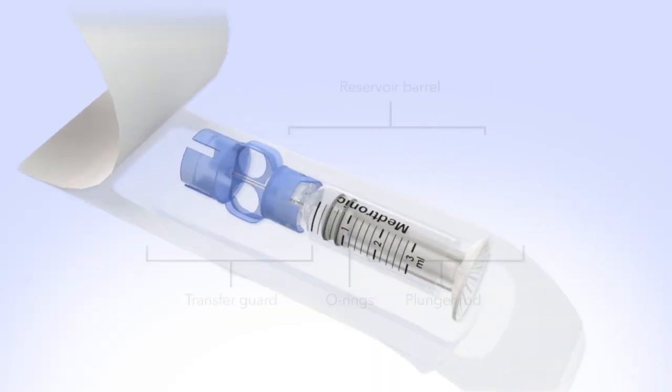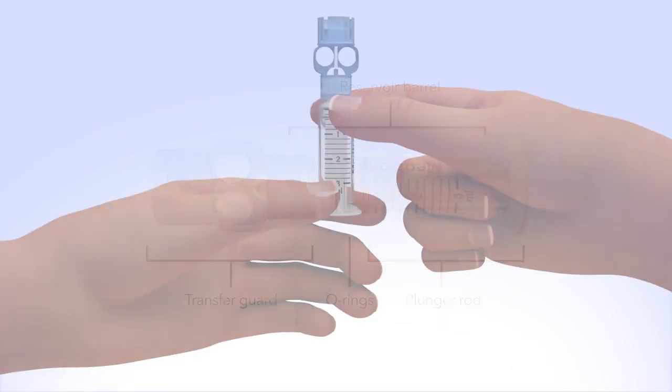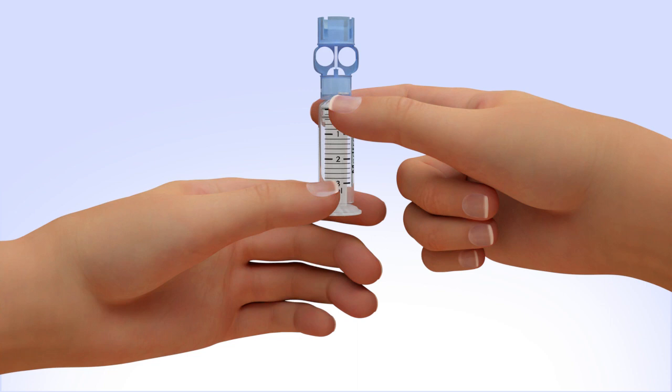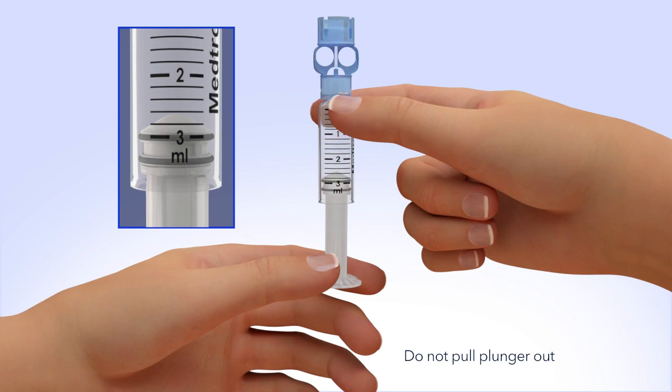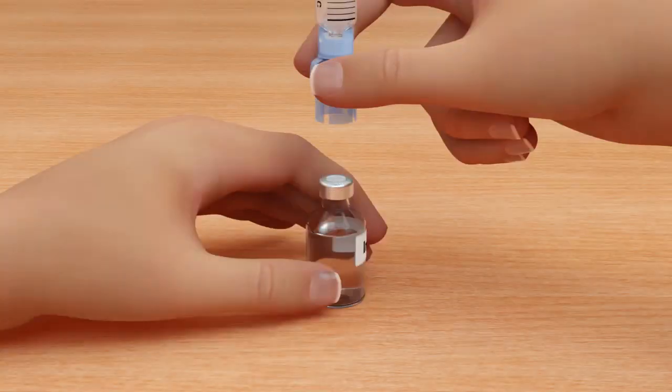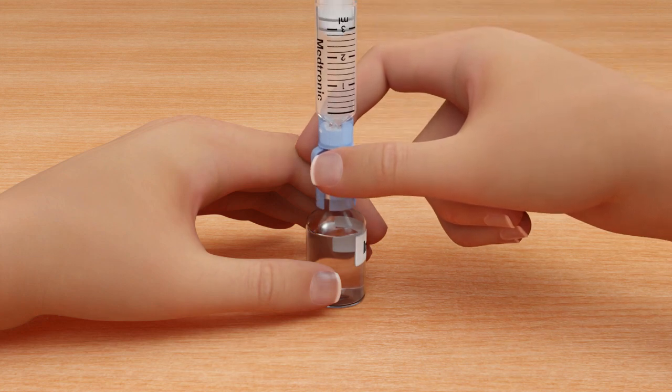Remove the new reservoir from the package. Pull the plunger so the top o-ring is positioned at the amount of insulin you plan to put into the reservoir. Be careful not to pull the plunger completely out. Hold the reservoir by the blue transfer guard and connect it to the insulin vial by pressing down. Do not push down on the plunger during this step.